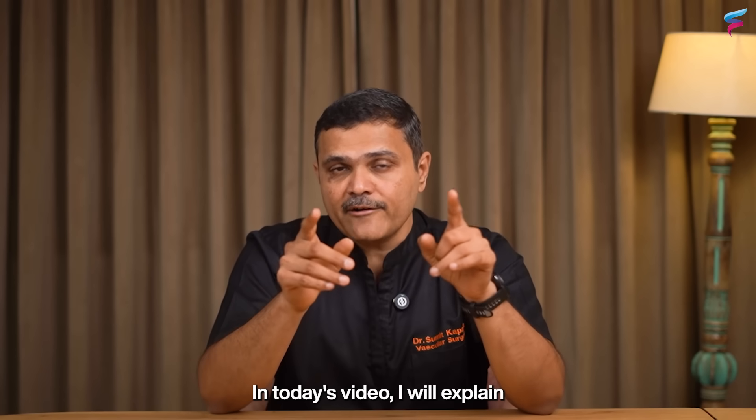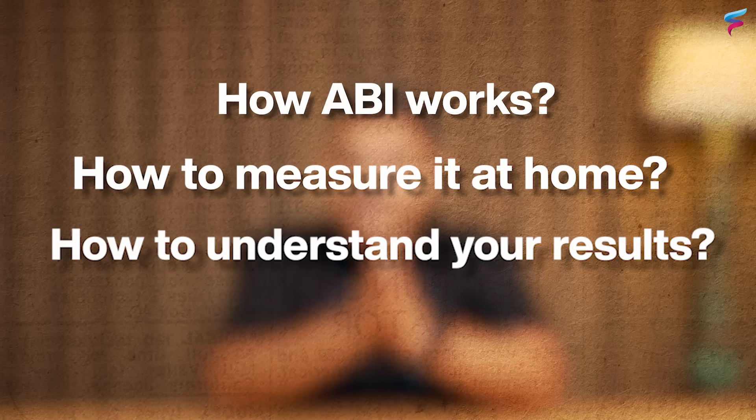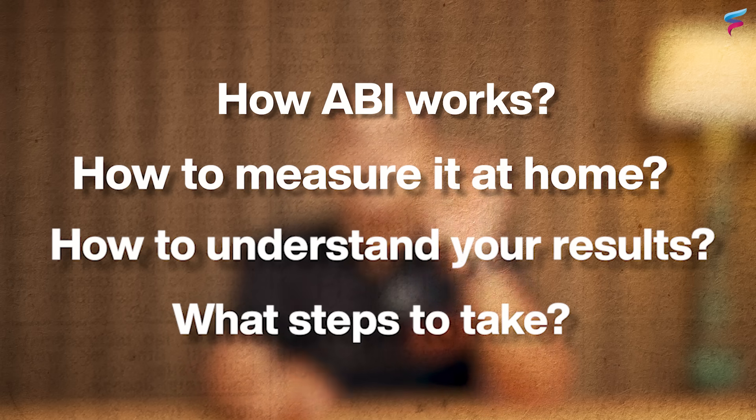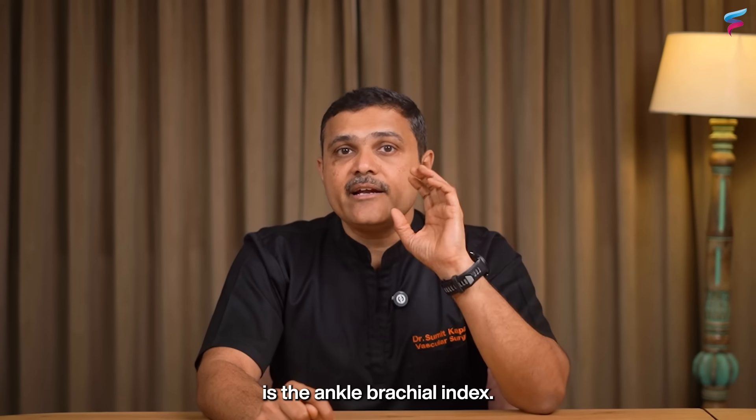In today's video I will explain exactly how ABI works, how to measure it at home, how to understand your results, and what steps you can take if something is abnormal. So let us first understand what is the Ankle Brachial Index.